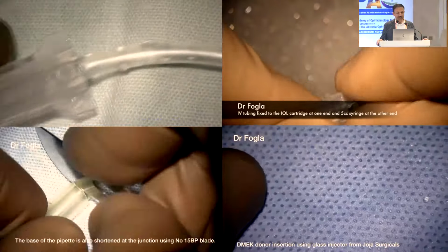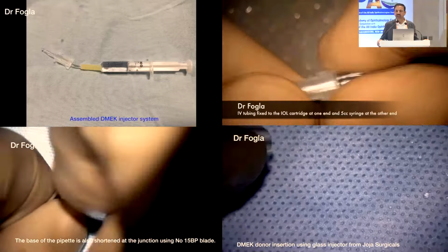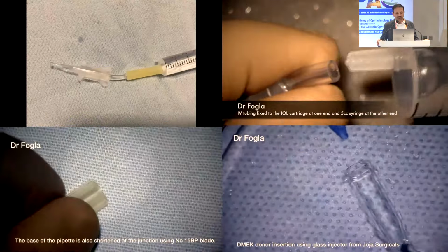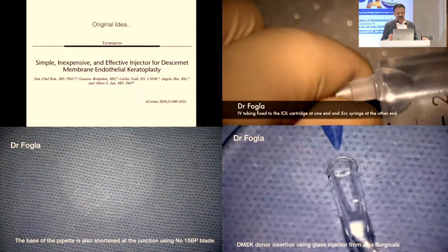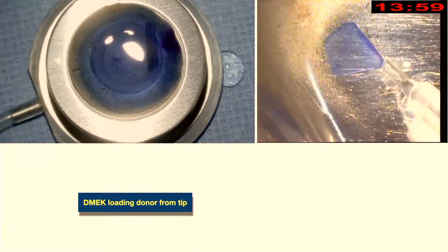It's basically a fluid-based flushing system where you flush the DM scroll into the eye. You're not pushing it like you push an IOL. All these videos are there on YouTube, so you can look up the exact execution of the insertion.